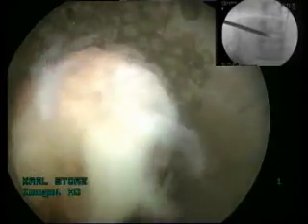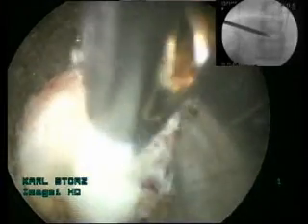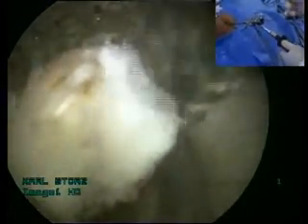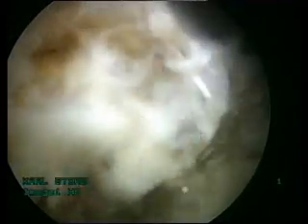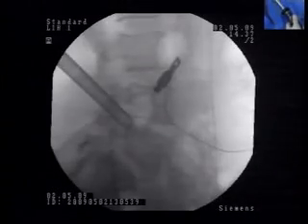The instrument is seen lying below the fragment, and the intradiscal portion of the fragment will be removed with a grasper. We also use bipolar radiofrequency cautery to reduce the volume of the nucleus, which is part of the herniated fragment, and use the grasper further to reduce the fragments. More portions are removed and we slowly reposition ourselves extradiscally to target the fragment lying outside the disc level.